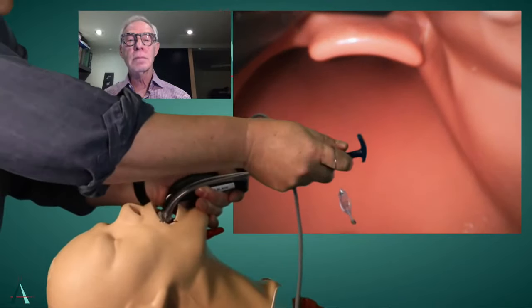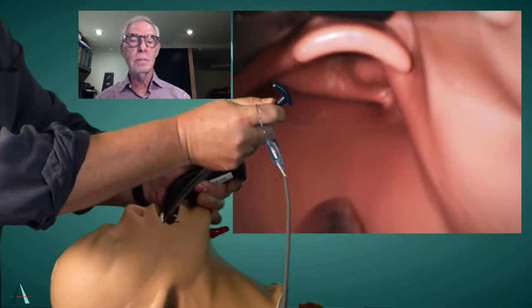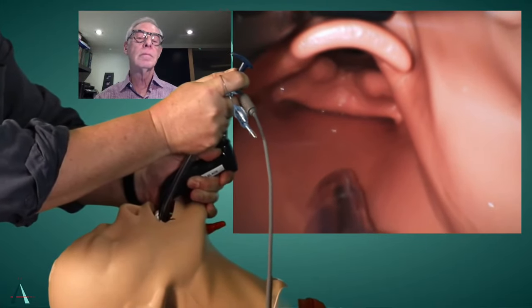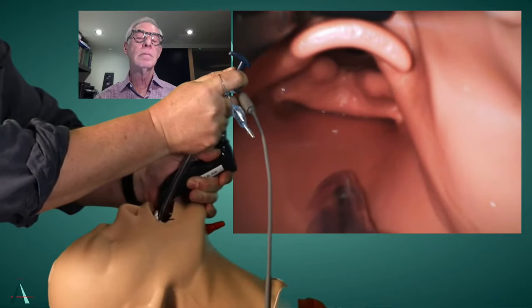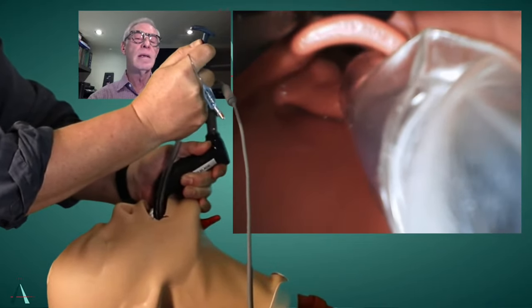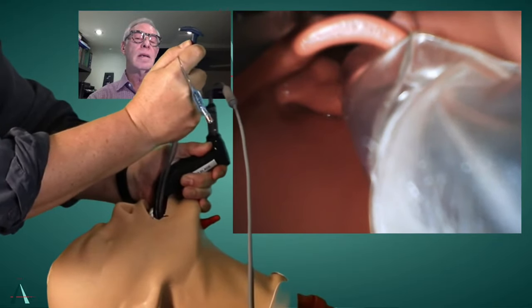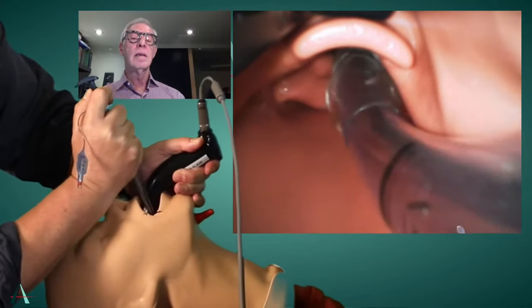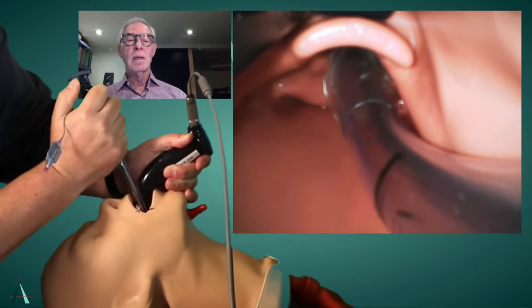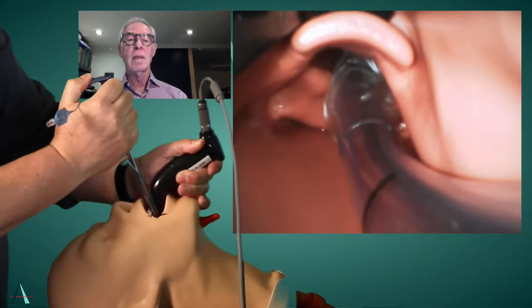So you can see there that when you bring that in between the cords, we're between, below, before, and then we do the Cooper maneuver and we just come up, and now you're much more in the plane of the larynx without impacting on the maxilla, and then that angulation forwards, and it just goes in. And then the next step, Richard, do you have any tips?